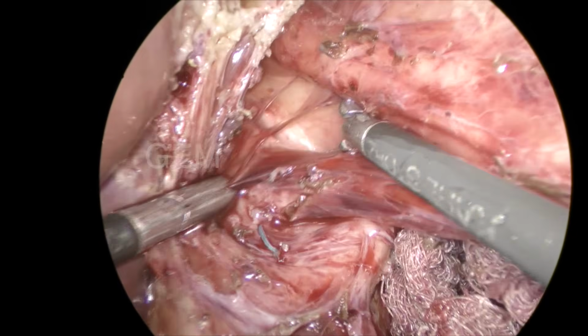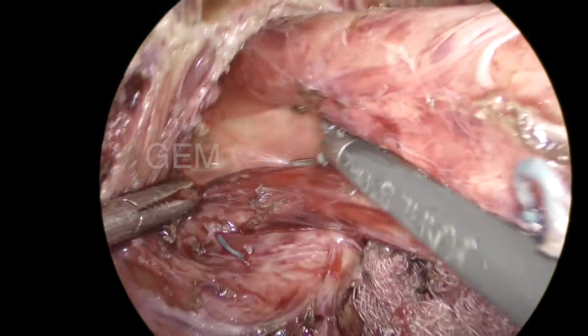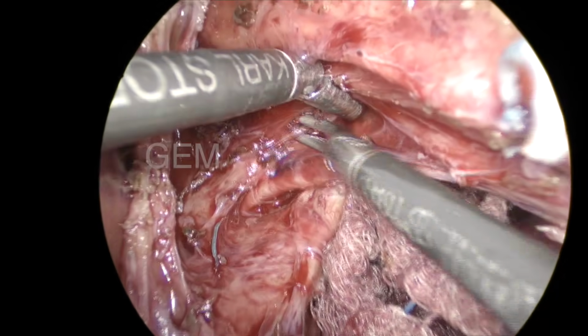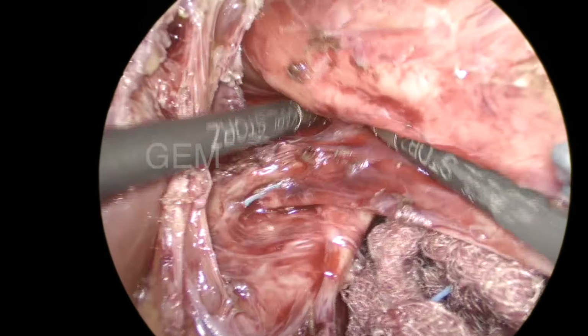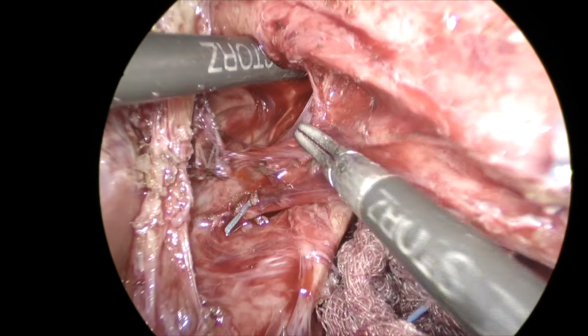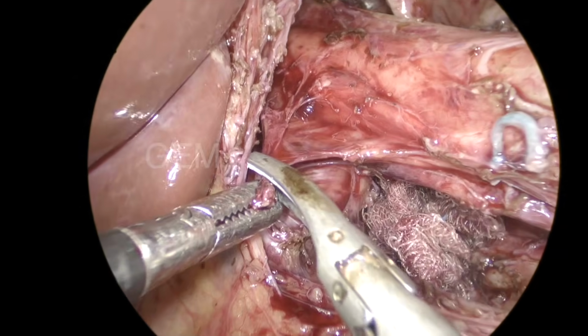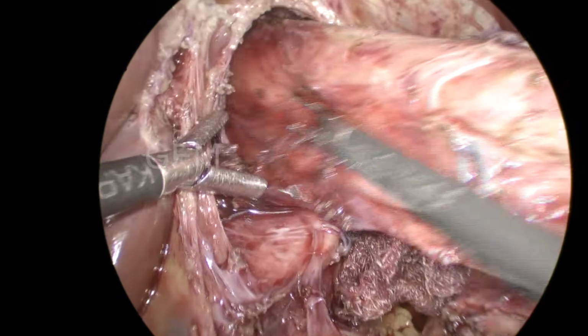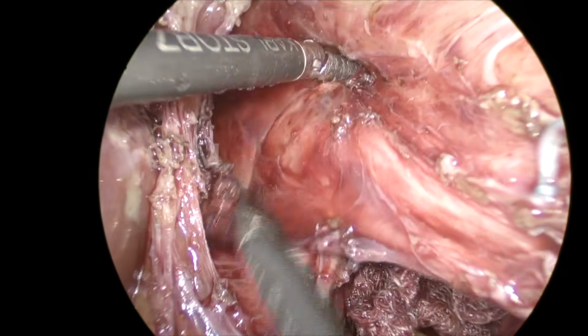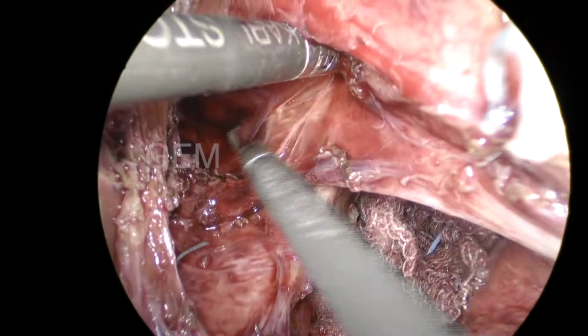We can go up to 6 centimeters with the myotomy, but the tortuosity should be straightened. Now you can see the pleura; I am separating the pleura from the esophagus. Still it is not separated fully.